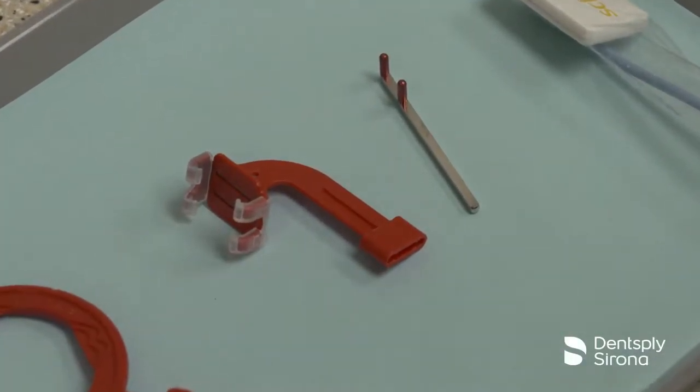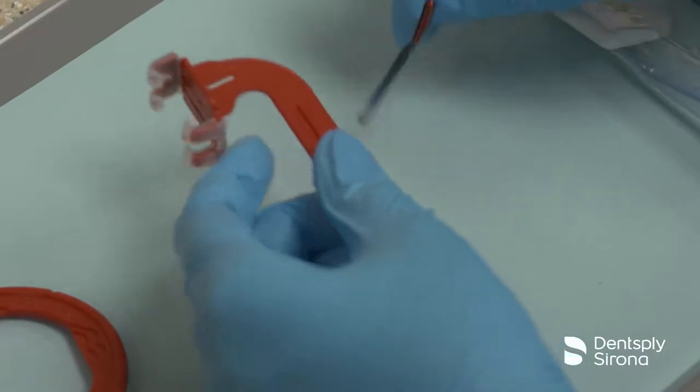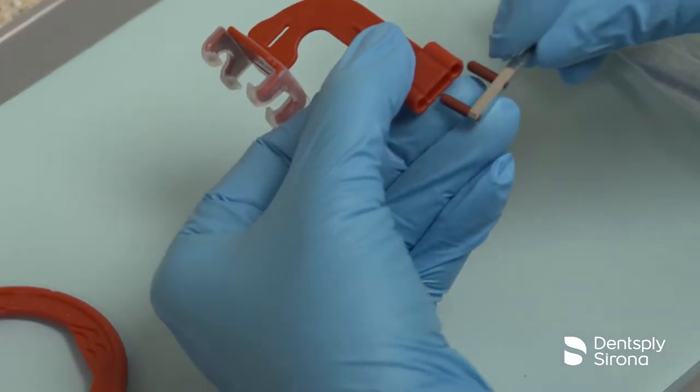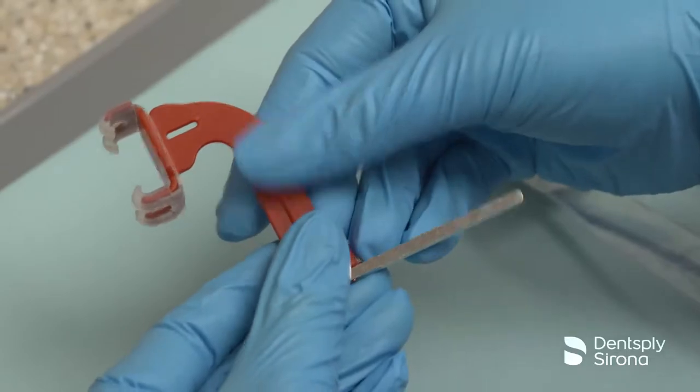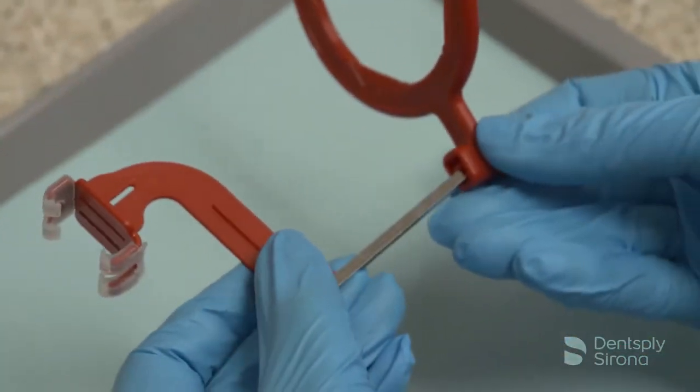To assemble the XCP short arm with the XCP DS-FIT bitewing bite block for images, place the red pins on the arm into the side of the red bite block and slide the arm into the red aiming ring.